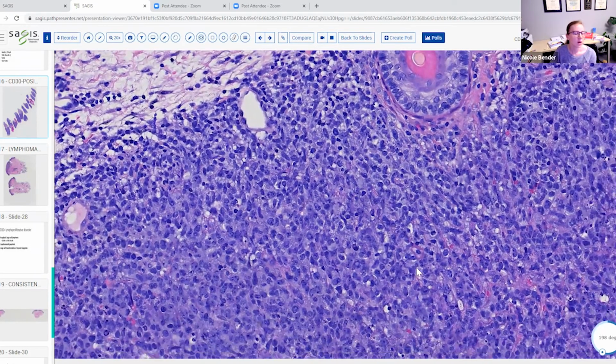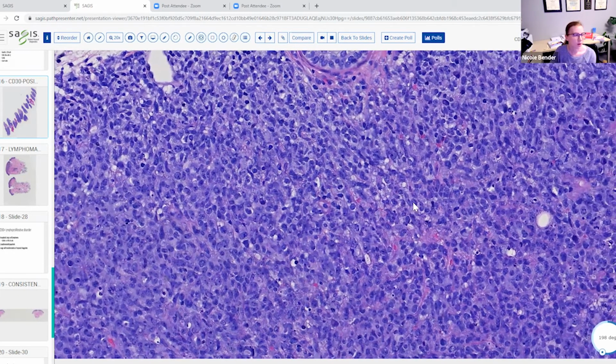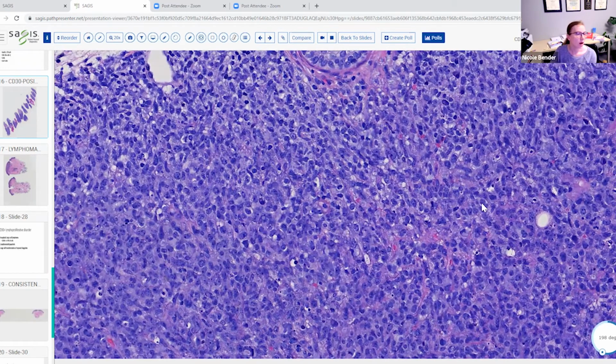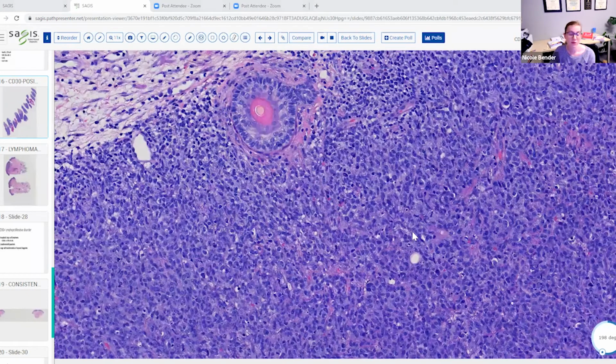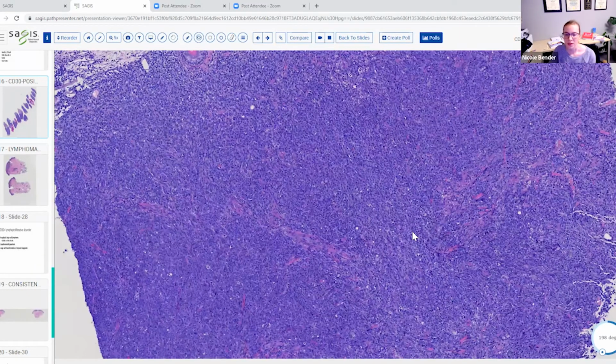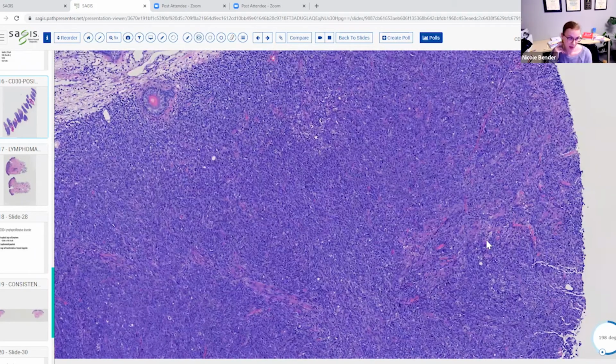So these are very large cells, really reminiscent of that diffuse large B-cell lymphoma that we looked at earlier, because these cells are large, they're abnormal, they've got irregular nuclear contours, they've got prominent nucleoli, there's frequent scattered mitoses all over. So this looks malignant again, right? So we have to use the immunophenotype to help us for this. There's no architecture that's helping us. We just have large malignant looking cells. So this immunophenotype is CD3 positive, CD20 negative, CD4 positive, CD8 negative, and CD30 positive.